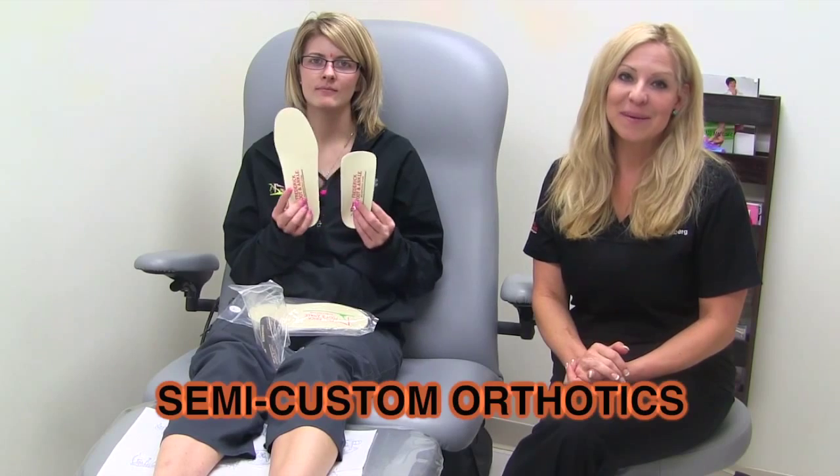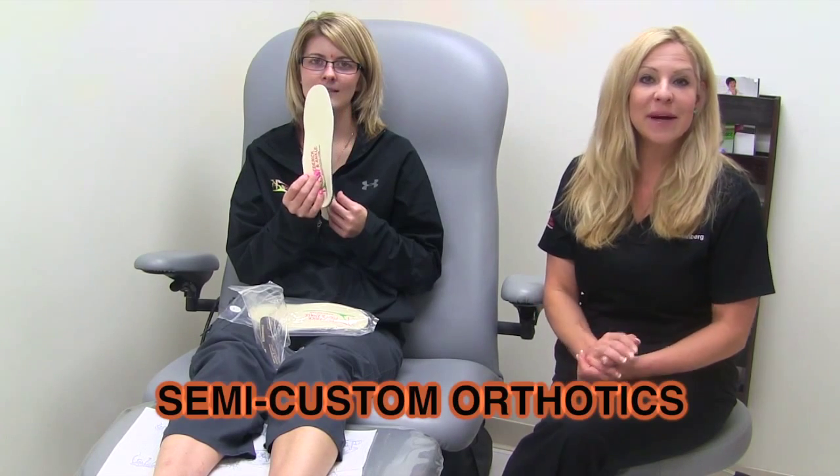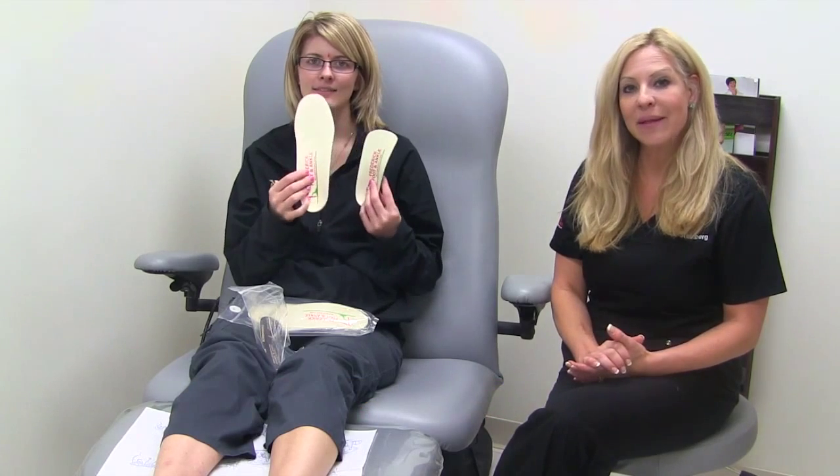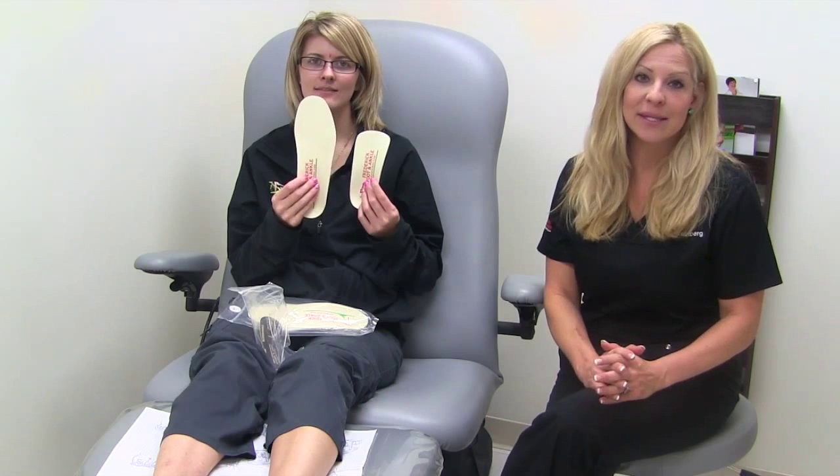These are semi-custom orthotics made by Dr. Jill's. They are arch supports and orthopedic devices which are used to treat or adjust abnormal foot motion. They provide support, stability and control. They also increase your balance, absorb shock and relieve pressure on uncomfortable spots of the foot.